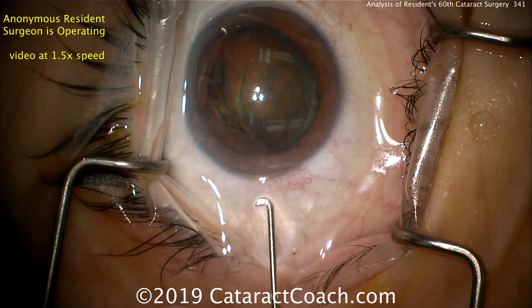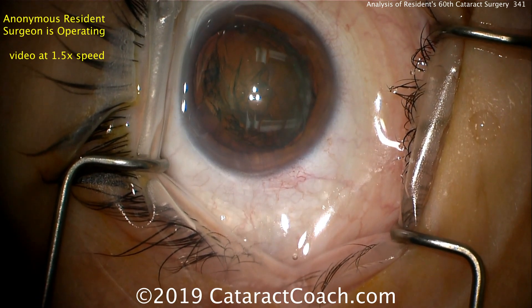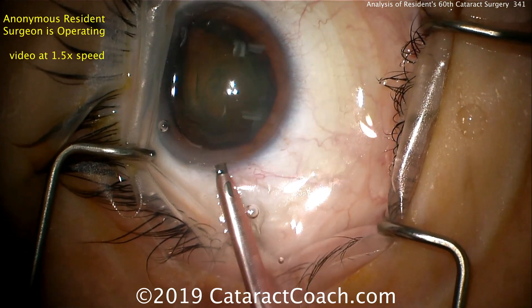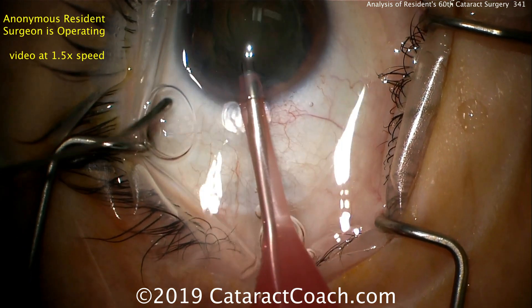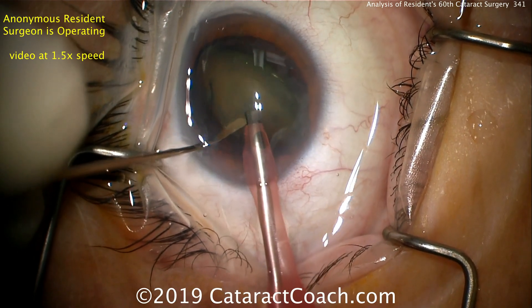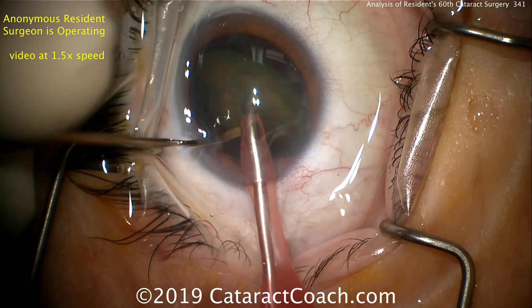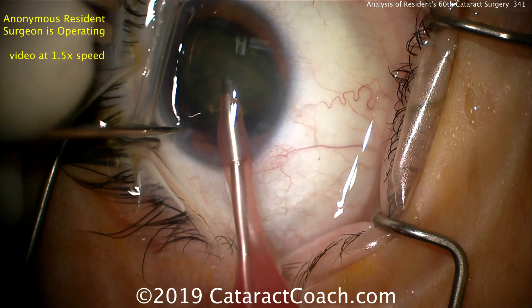The nucleus is partially prolapsed out of the capsular bag. Remind you that this video is shown at one and a half times speed, just so we can get through the whole video in a reasonable amount of time. The phaco tip going inside the eye looks like a smaller sleeve, maybe 2.2 or 2.4 millimeter, and a spatula on the second hand.